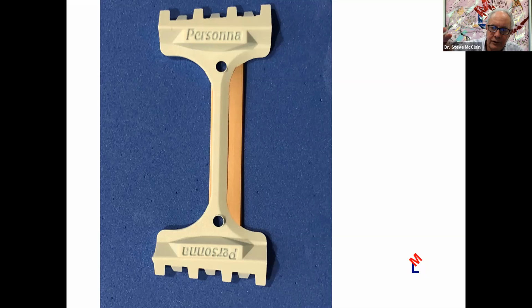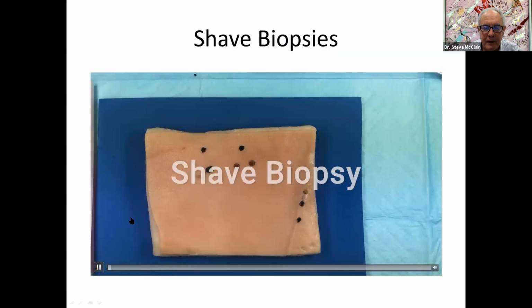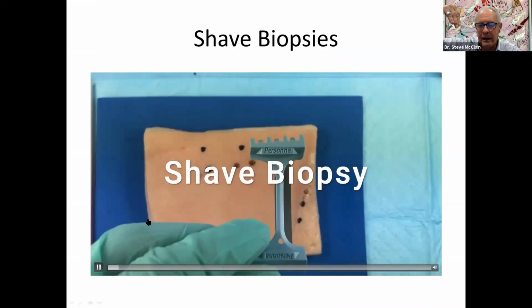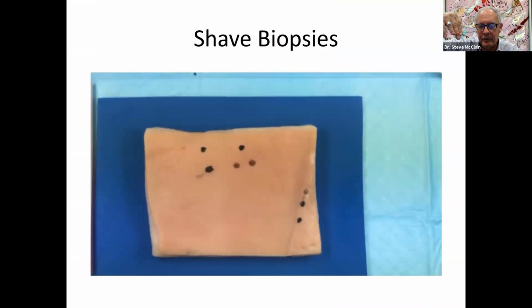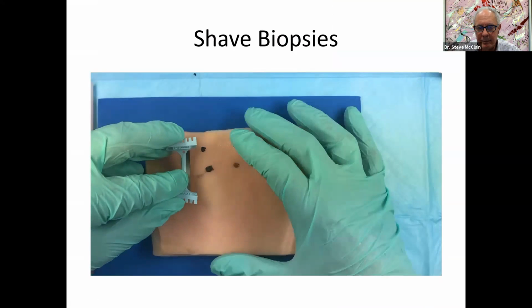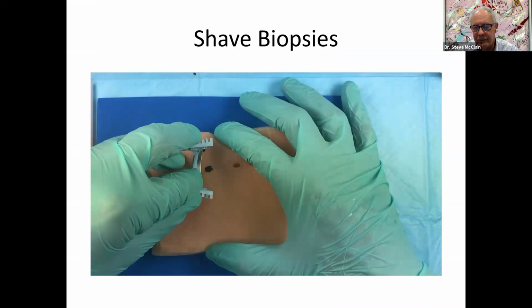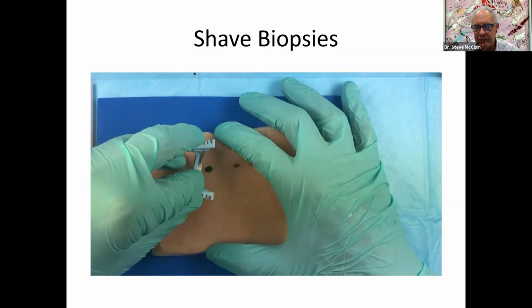You will use your index finger to bend the blade down and do it. So here's a shave biopsy. Again, you come in at a high angle, 37.5 degrees. Now this young man is left-handed. He's bending the blade with his index finger, and now he's going to come in at a high angle. He's tilting it, cutting 37.5 degrees.